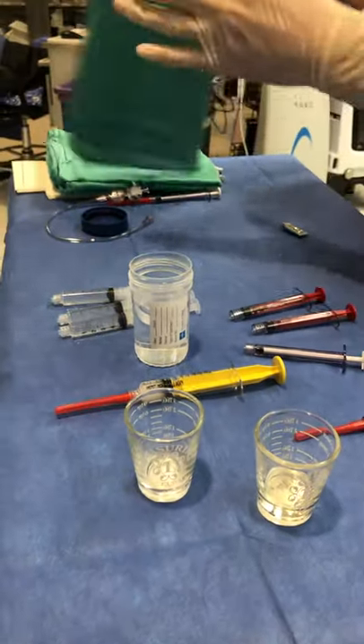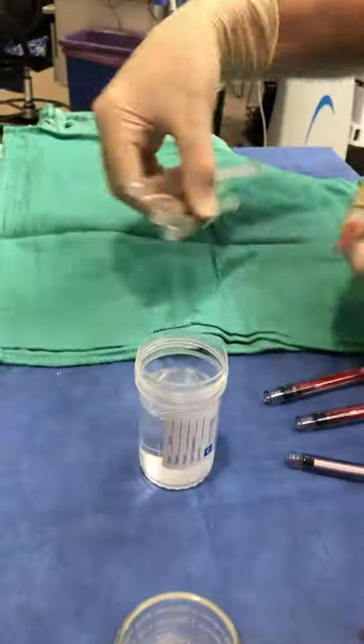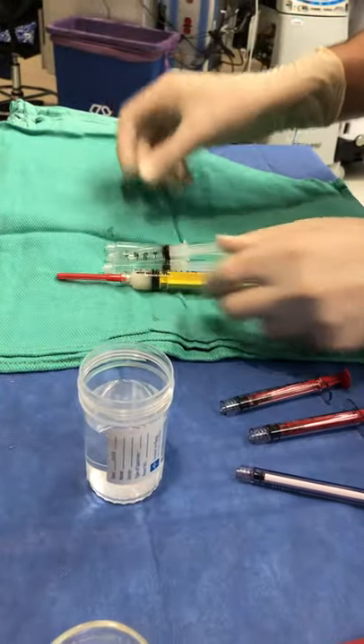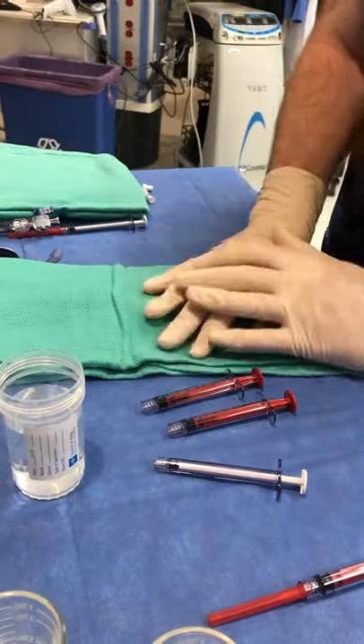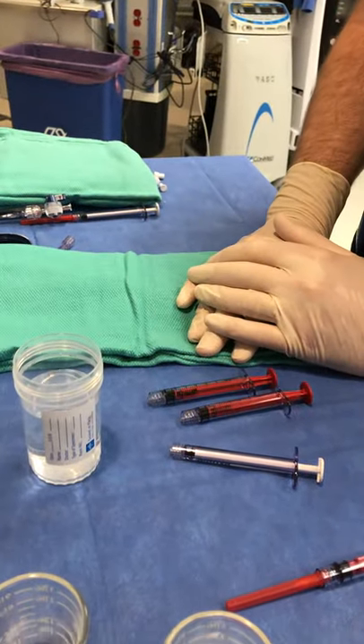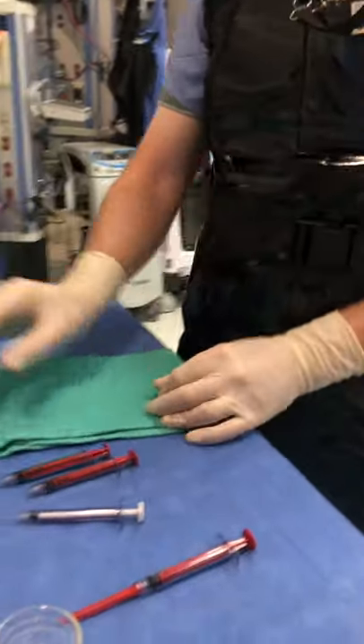We usually get a green towel and put everything you're going to use onto the table, then take it up to the field with new gloves on. This should all be done with new gloves — no blood on your gloves. And that's it. That's perfect. Thank you.